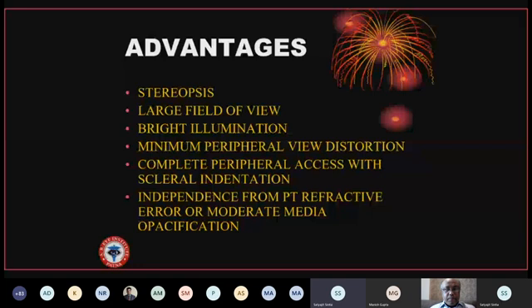The direct ophthalmoscope has a good 15 times magnification. It shows you a virtual and erect image, whereas indirect ophthalmoscopy gives you only about 3 times magnification. But the limitation of direct ophthalmoscopy is that it has a field of view of only 5 degrees, whereas in indirect you have almost 45 degrees of view, and you can also see the posterior pole and the periphery.